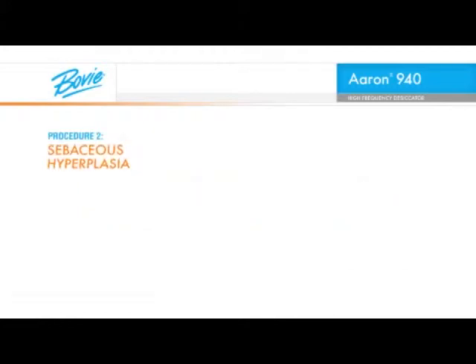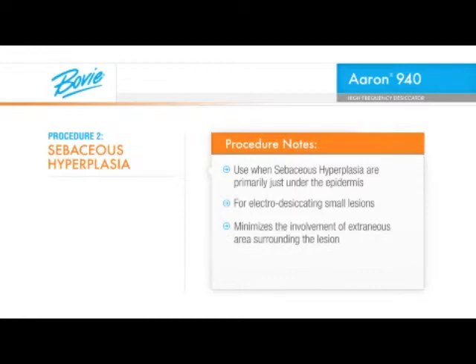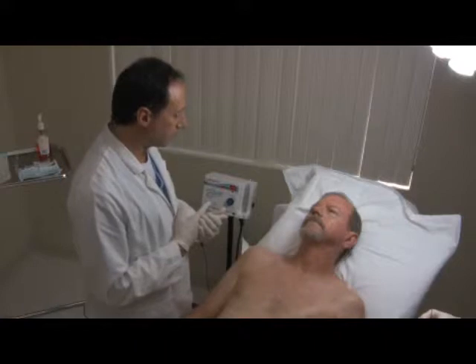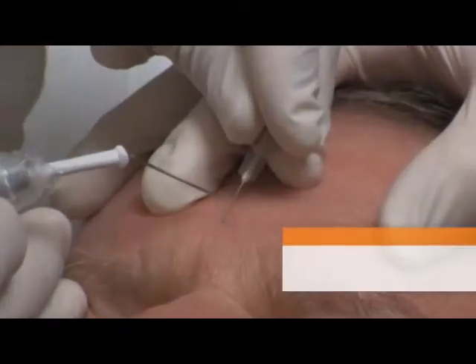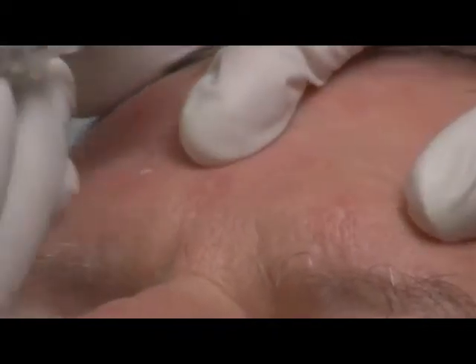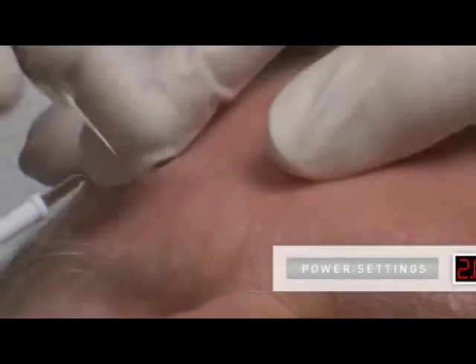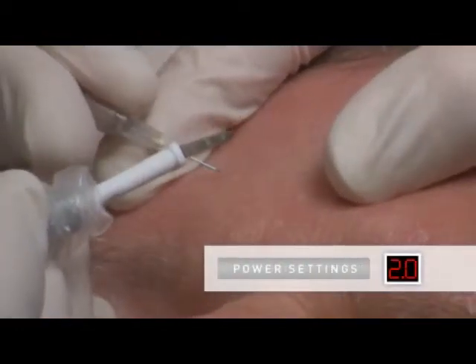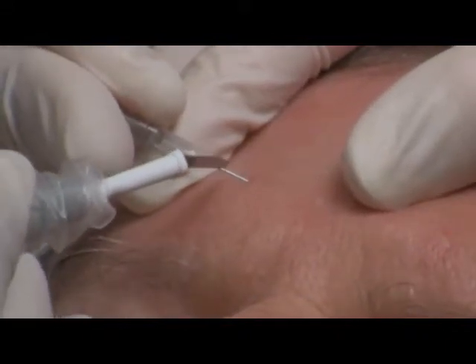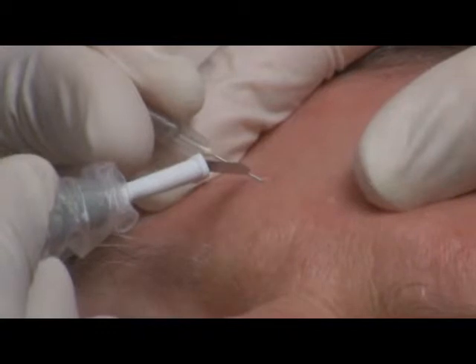When treating sebaceous hyperplasia that are primarily just under the epidermis, the following technique is very useful for electro-desiccating the small lesions, minimizing the involvement of extraneous area surrounding the lesion. Local anesthesia for minor lesions such as these is not required. The ARIN 940 is used with an A804 dermal tip electrode and a 27-gauge needle. Expose the area being treated by stretching the skin surrounding the lesion. Place the tip of the needle on the side of the lesion and penetrate it superficially. With a power setting of 2 watts, gently make contact with the electrode to the needle and activate the handpiece. This will selectively electro-desiccate the lesion given the high content of water within the sebaceous hyperplasia compared to the epidermis.